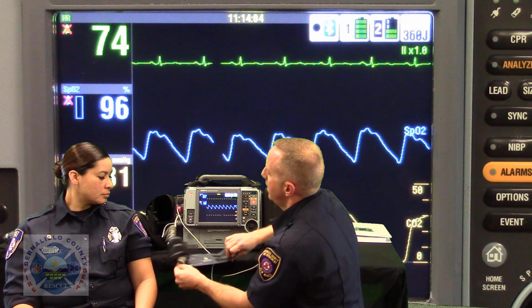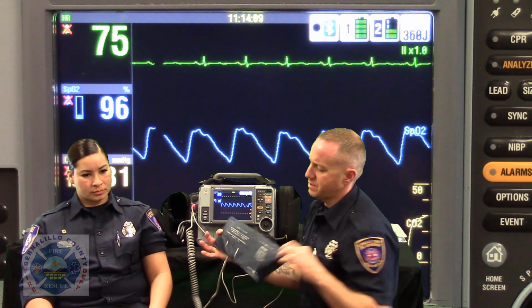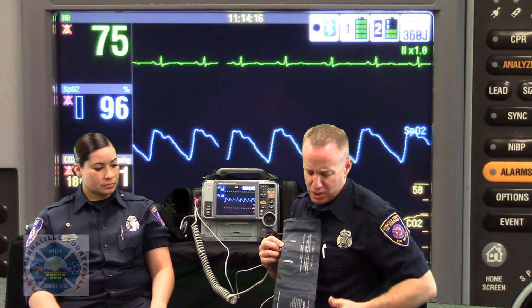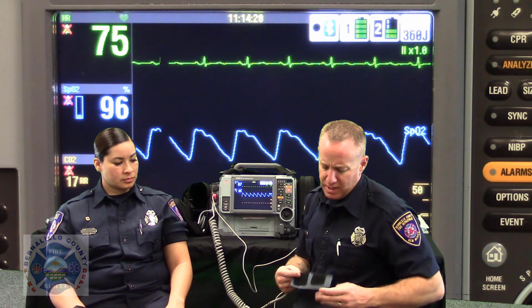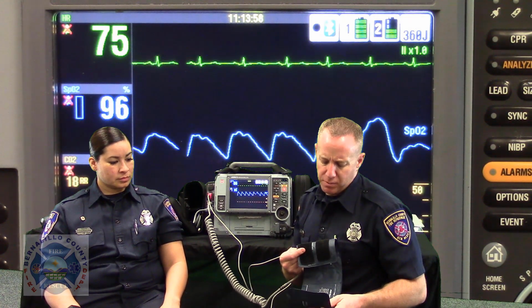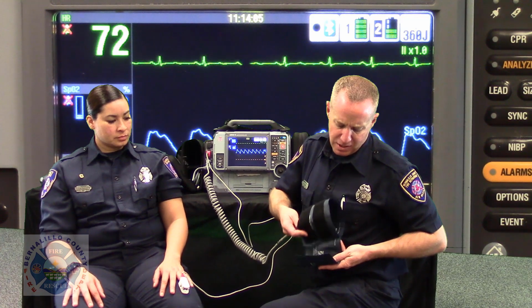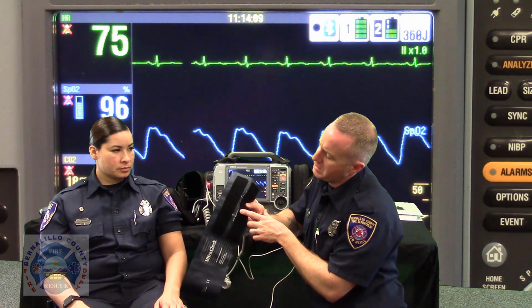Now, as I deploy my BP cuff, I want to make sure that the cuff is the correct size for the patient. So if your cuff is worn out and you can't see the range indicator and the artery lines and the index line on your BP cuff, I would suggest ordering a replacement from Logistics. But this is the range line from which you will be able to determine if this is the correct size cuff for the patient. Also, you have an artery right arm and an artery left arm.